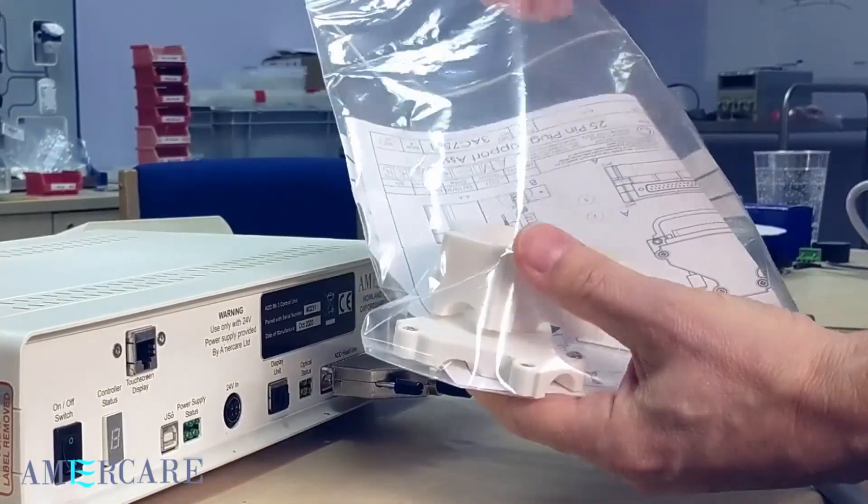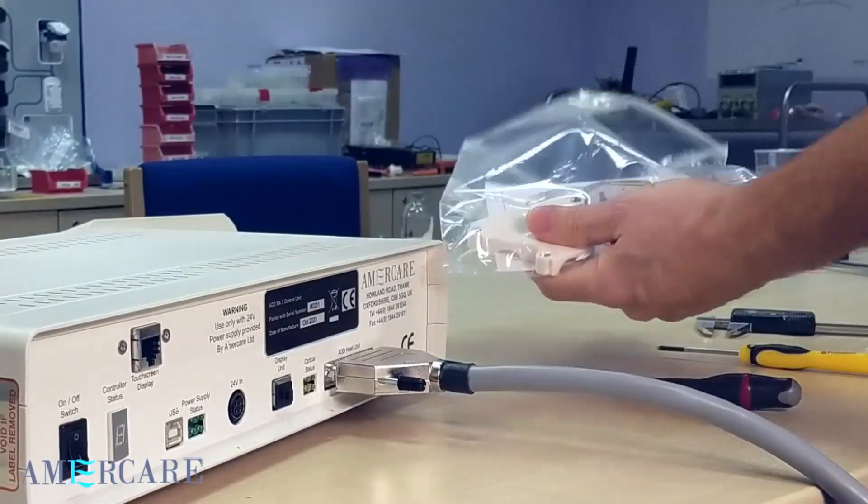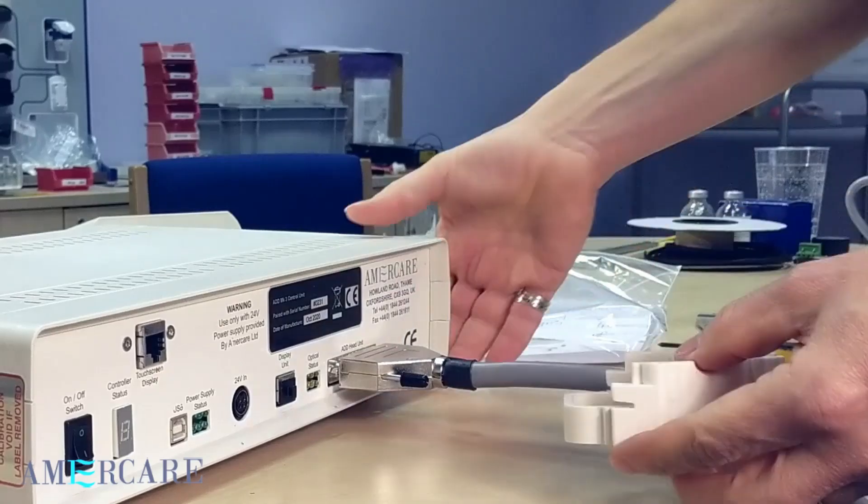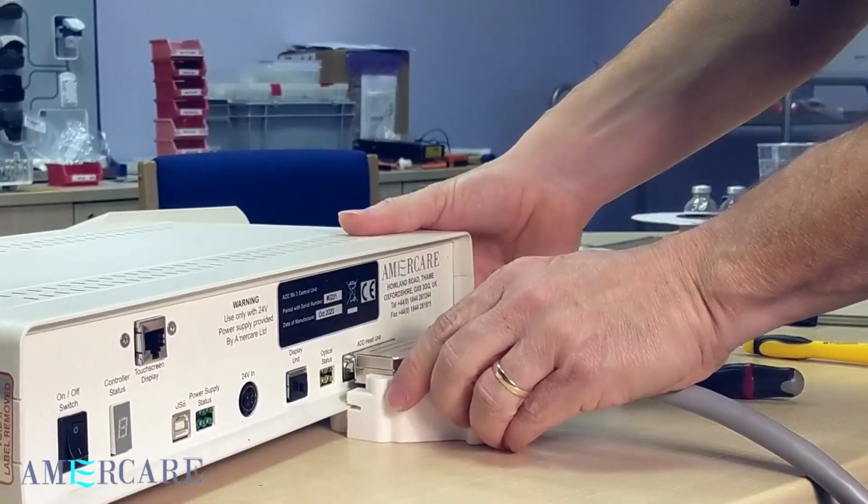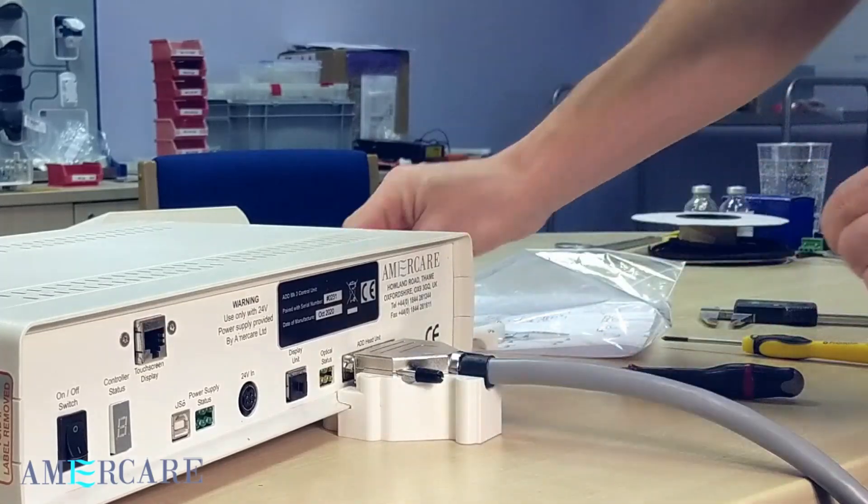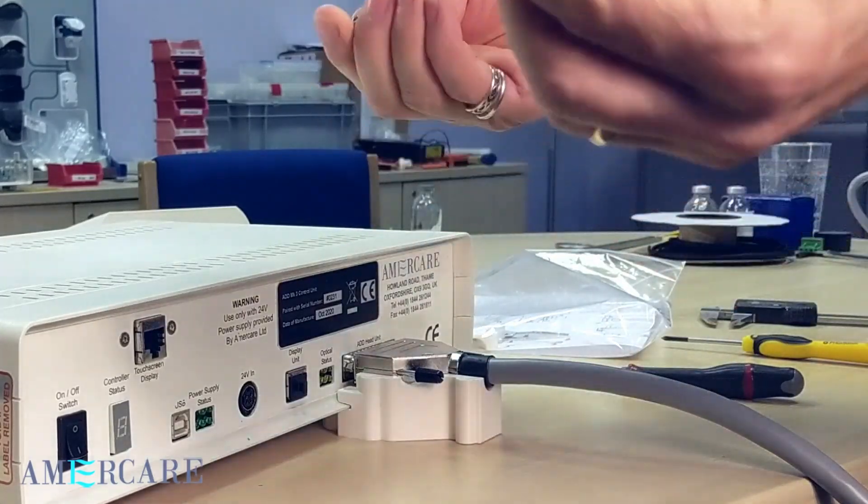We also supply this additional support assembly. Simply take this section, lift the control box up and sit it under the D connector. This slides forwards and is then secured by using the two supplied M3 screws.